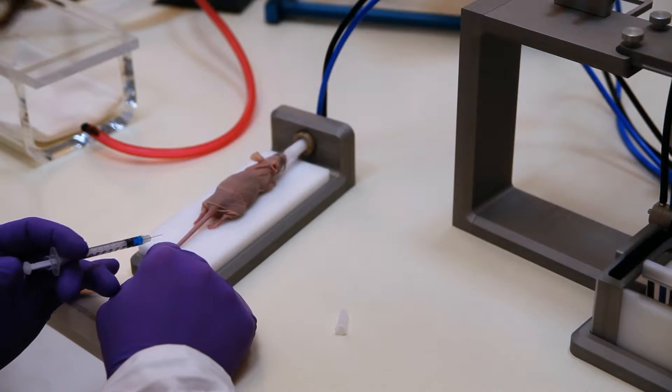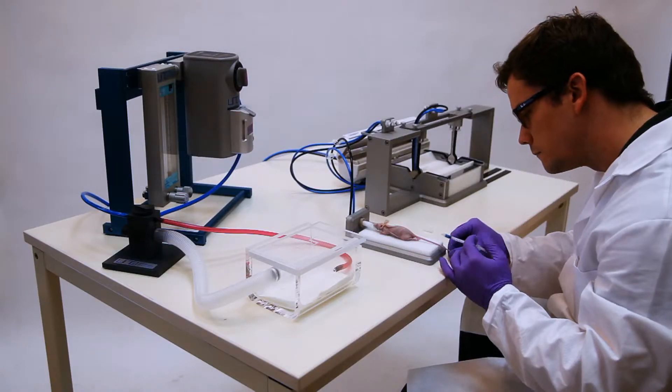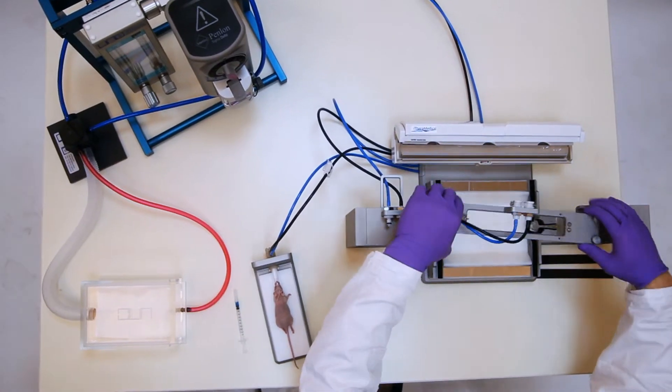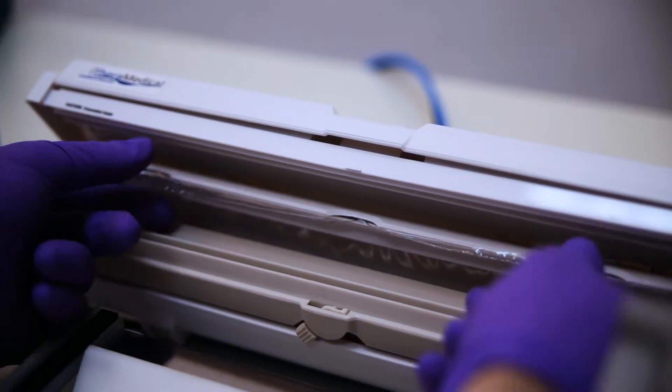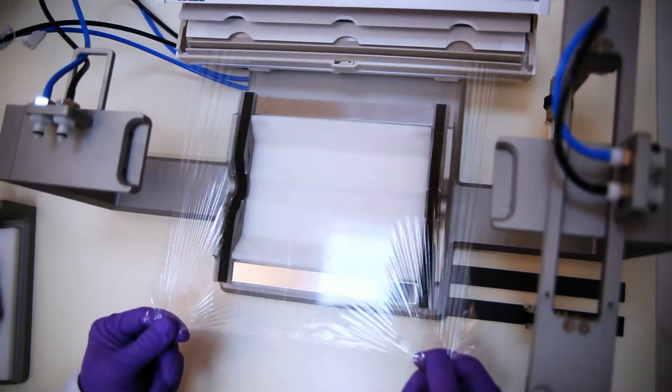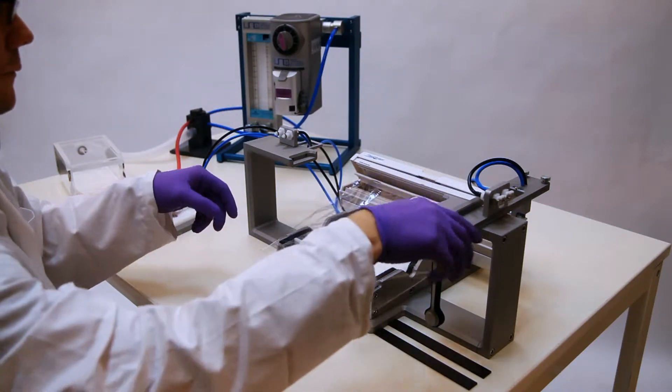Following the injection, the animal is transitioned from the injection platform to the preparation station. A plastic foil serves as a coupling membrane for the ultrasound signal and to separate the animal from water in the imaging chamber.